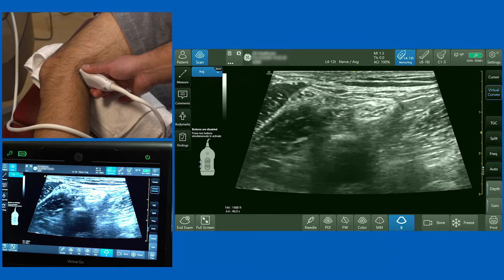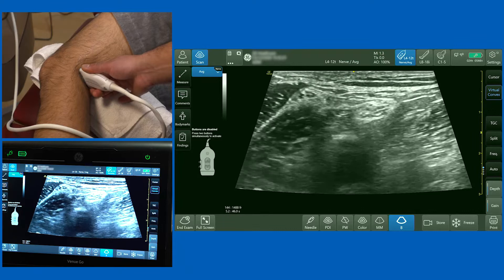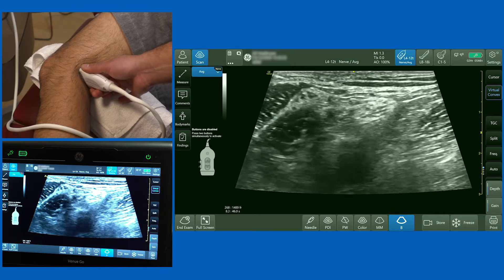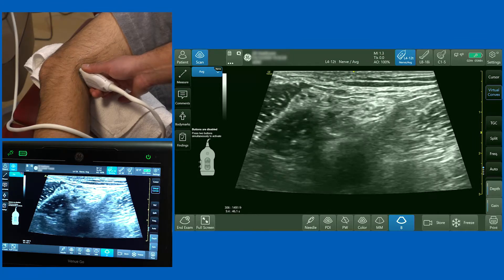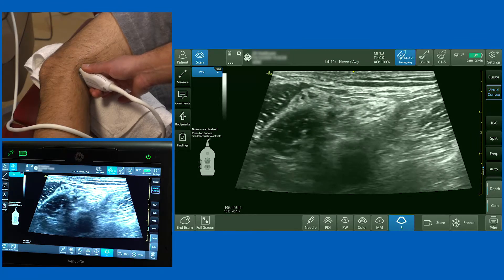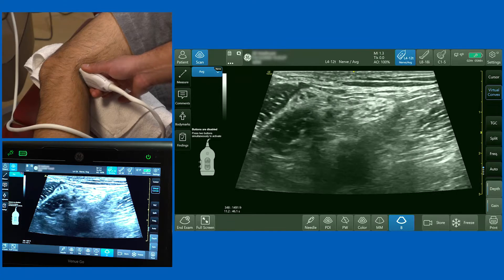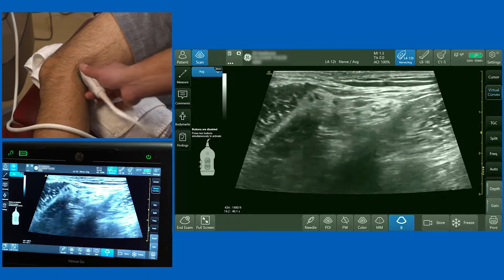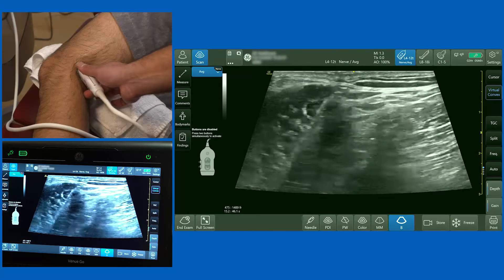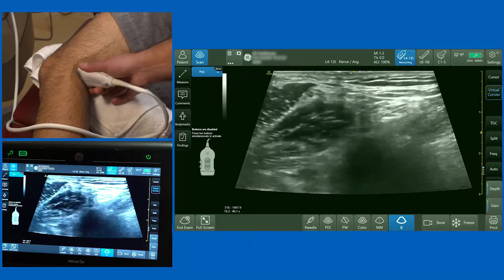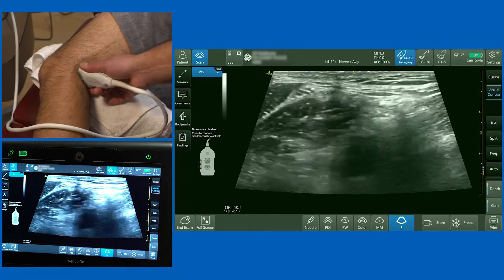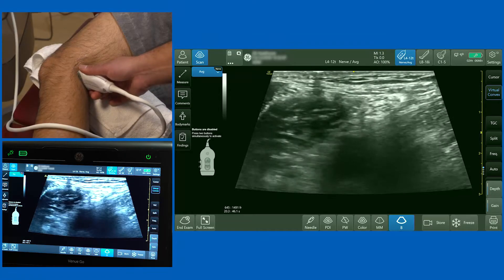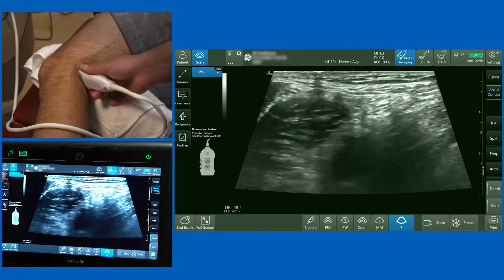After removing color Doppler, notice that the nerves in this part of the body are extremely anisotropic, which means if your ultrasound beam does not hit the target at 90 degrees you won't see it. I'm going to rotate and change the direction using tilt, and hopefully two structures become evident on the screen.